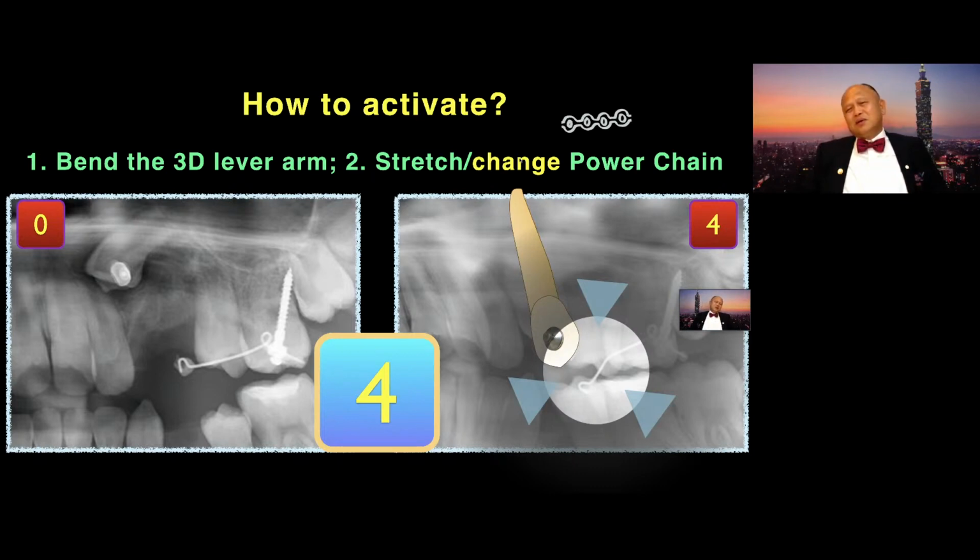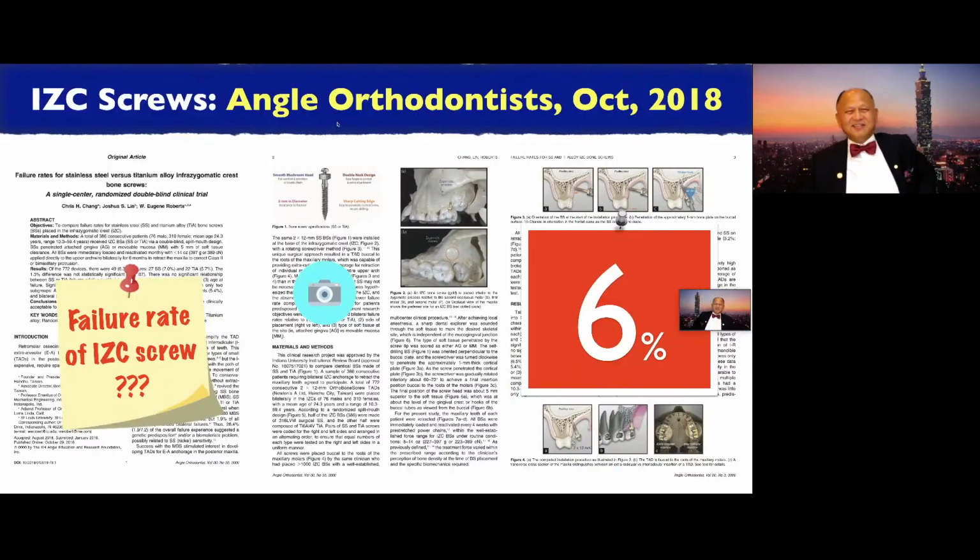So I would suggest when you activate it, try to slow down and take as many photos as possible. So then the patient feels that $300 is worth it. So you slow down to justify the $300 fee. But you only need 30 seconds.